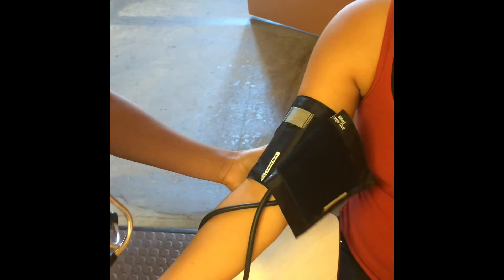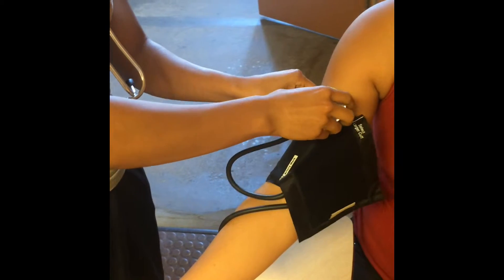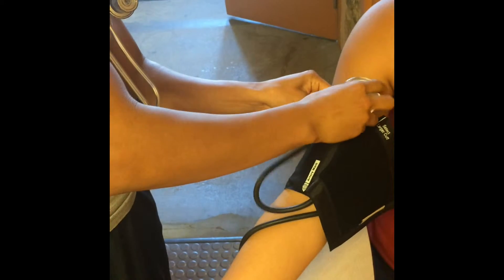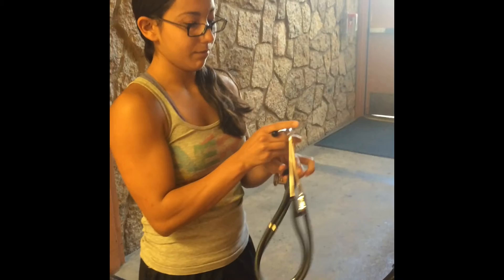Make sure the cuff is correctly put on, since the arterial marks should be on the side of the bare arm facing the brachial artery. In order to hear the Korotkoff sounds, you will be needing a stethoscope.